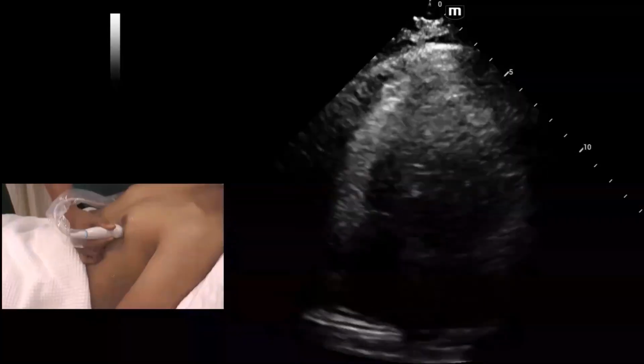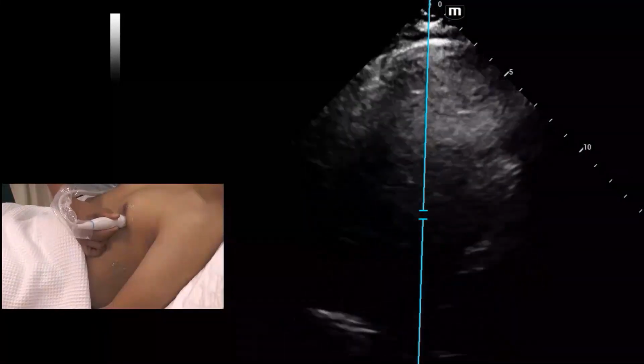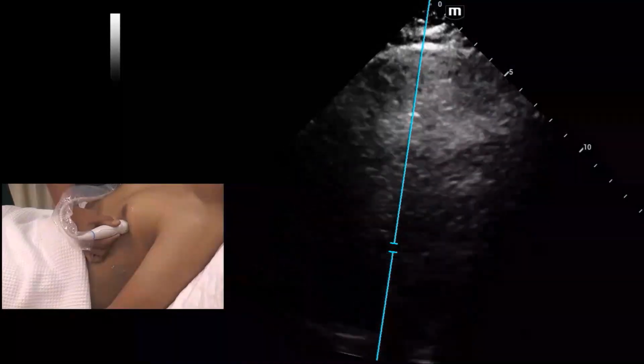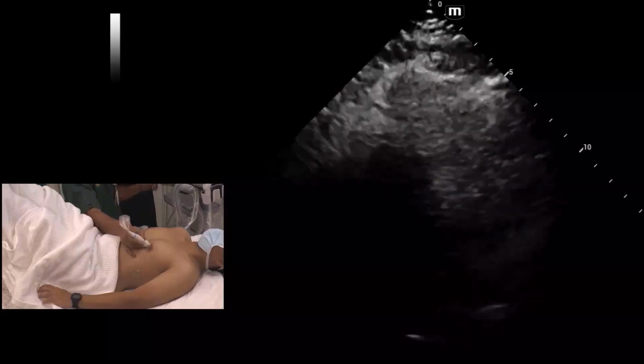Get the VTI. No, it's not nice. Okay. Then what happened is actually, you're going to elevate the lower limb. Okay. Then you can see increase in VTI. All right. Then after that, you increase the upper limb. Okay. Similar. You can see increase in VTI velocity. Right.